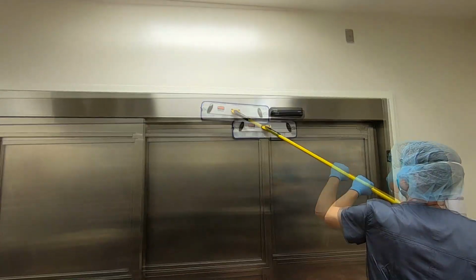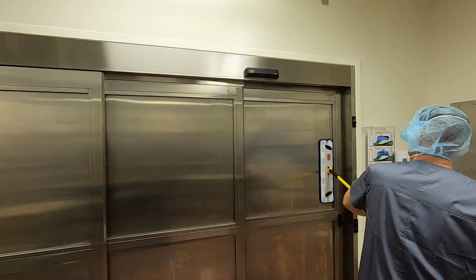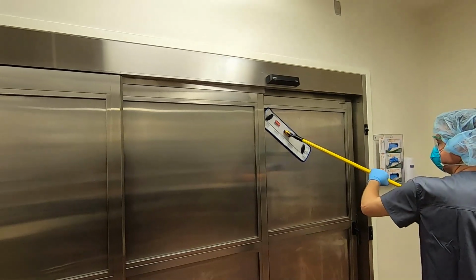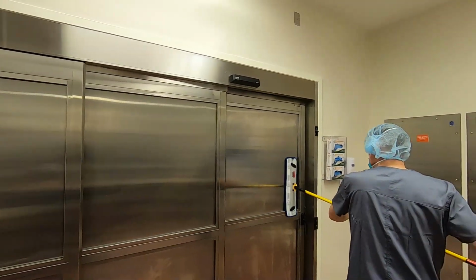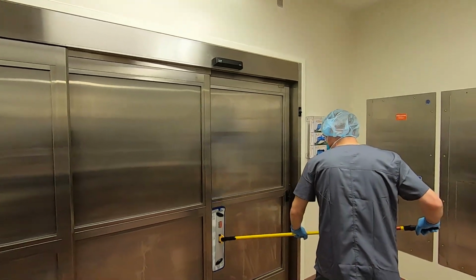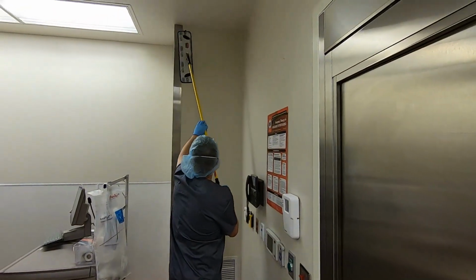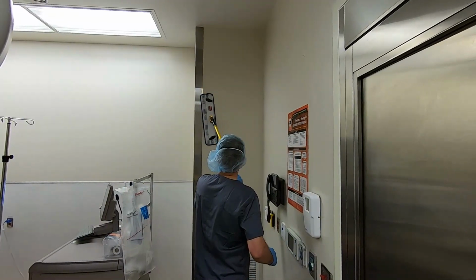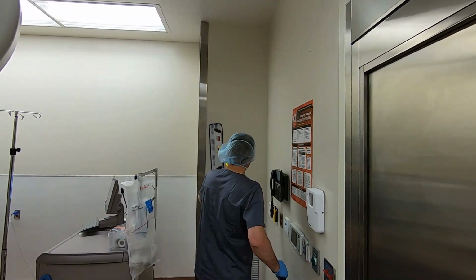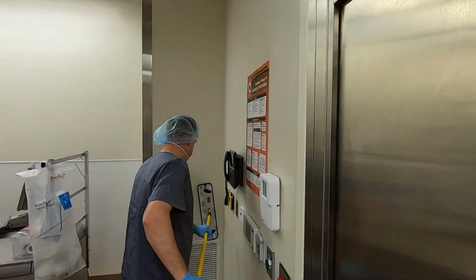This is very similar to the mopping that you do on the floor or the wiping with the microfiber towels. There is a leading edge, and this leading edge and consistent pressure ensures complete microbial removal of any pathogens that may be present on environmental surfaces. This is an infection prevention best practice. By following the path around the room in a methodical manner, we are ensuring that no items are missed, no walls are missed.